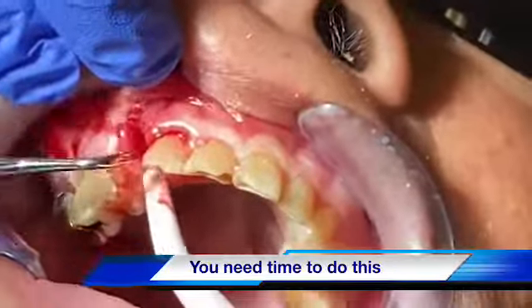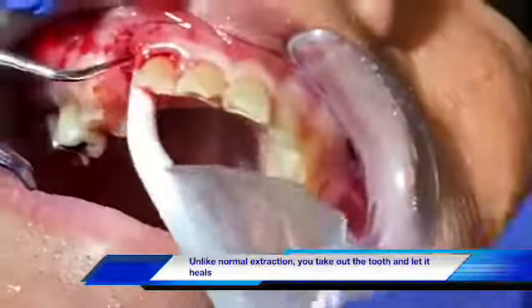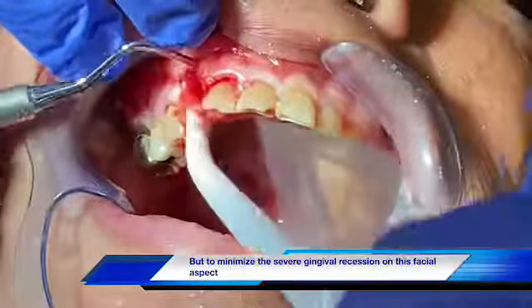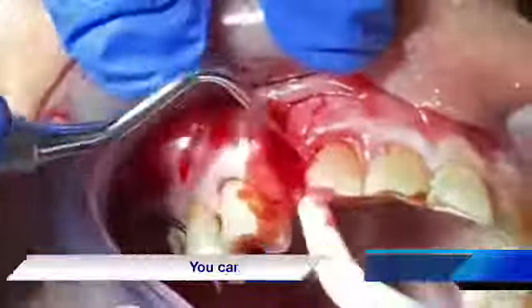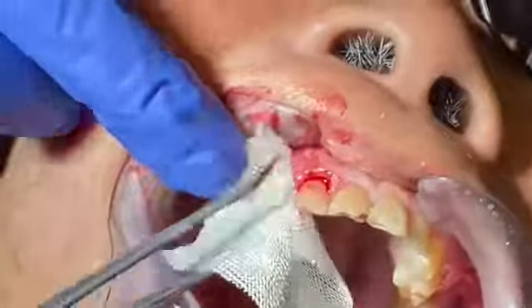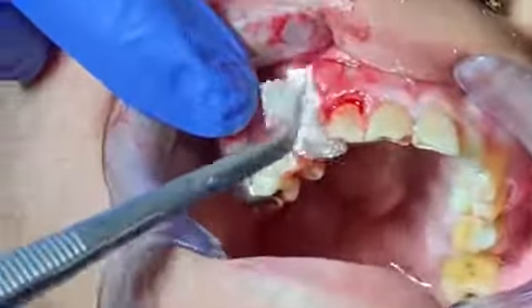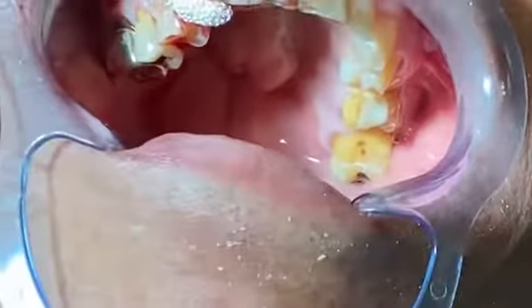If it's a conventional procedure, you take out the tooth and just let the patient go home — that's one way to do it. But to really help the patient minimize the recession area, you can put some collagen membrane after you clean this area well, remove all the granulation tissue, and irrigate the gum really well. Then you can design a flap technique where you release the adjacent teeth on both sides and close that defect area with some collagen membrane in there.